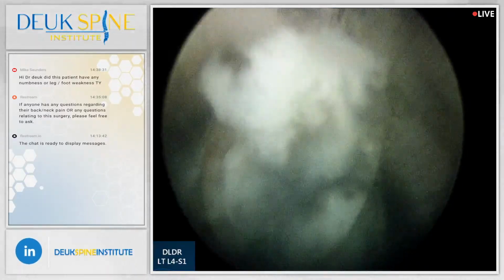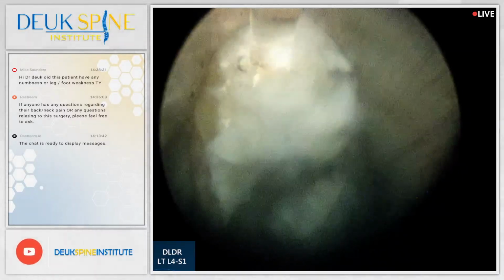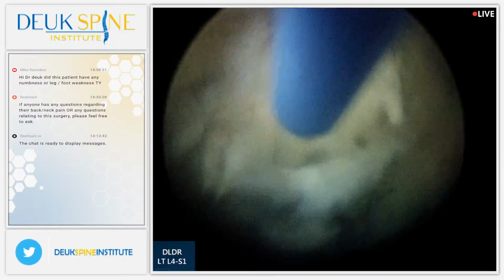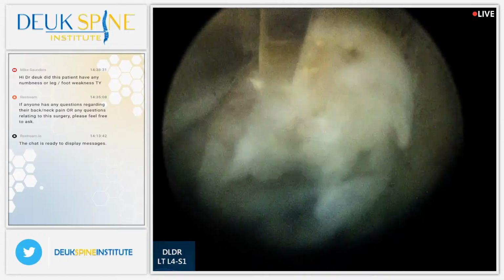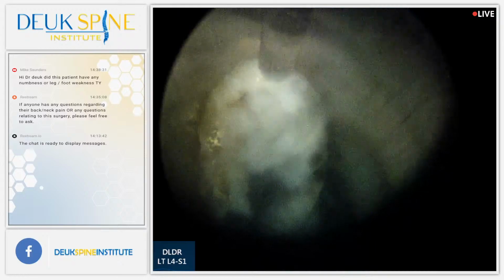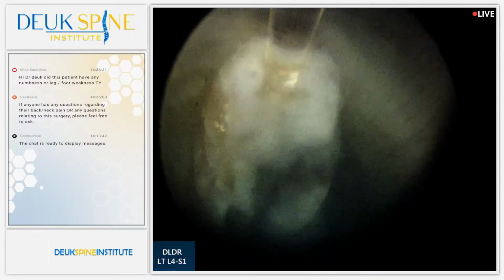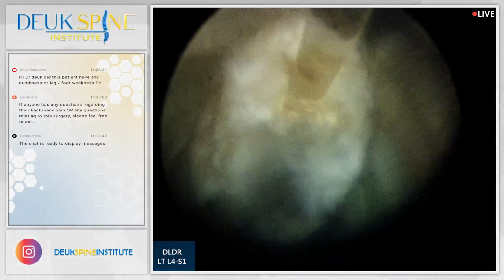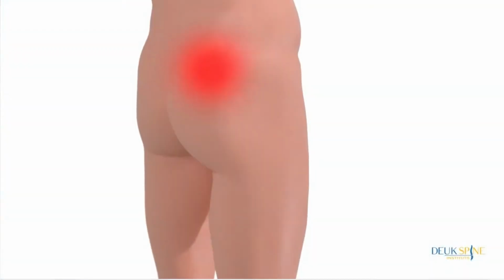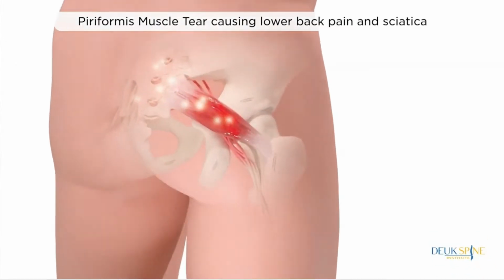All right, we're gonna be done here at L4-5 soon. We're gonna move on to L5-S1. Now remember, she has more than 2 bad discs causing back pain and leg symptoms. She also has piriformis syndrome on both sides. Why don't we show the audience what piriformis syndrome is? Of course. A piriformis muscle tear can cause lower back pain and sciatica.